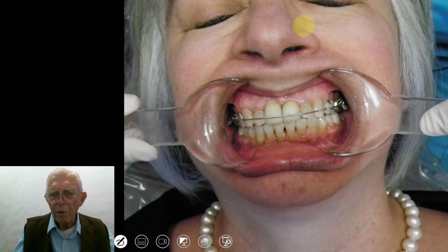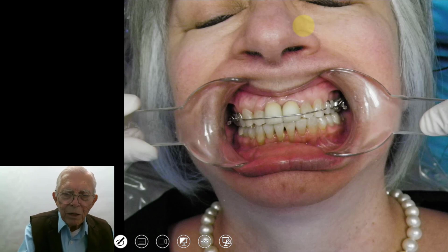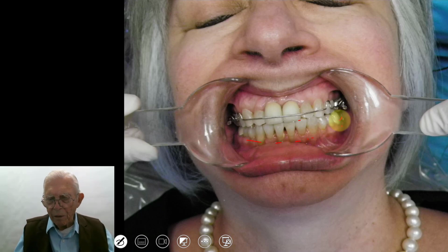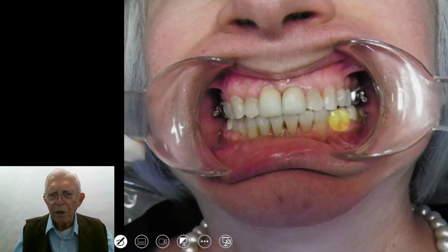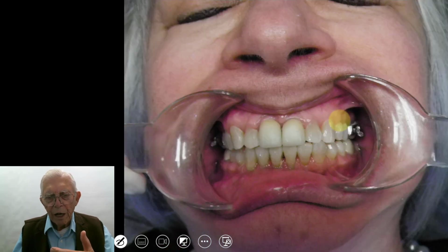Now, here we are. This is the same lady, and when she bites together, these teeth are out with the other teeth, and they've still got bone structure on them. So we use this lip bumper to bring it out there. So you've got to run interference. It's absolutely a necessity that you put something in there if you're going to bring those teeth forward, so the bone has to fill in and work out like that.